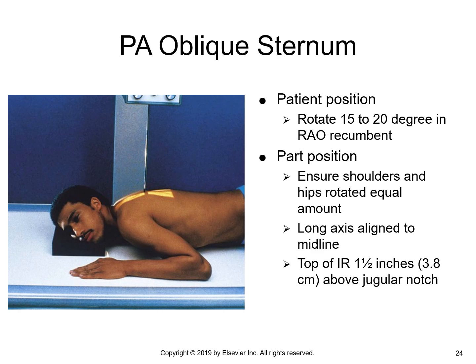Okay. Make sure your patient is running down the long axis of the table or is standing straight up and down and not leaning to the left or right, because that will affect how the sternum is oriented relative to your image receptor. Okay, there is no tube angle. It's a 40-inch SID. Actually, it's 30-inch SID, but most of your modern machines will have a safety override. It will not actually let you shoot at 30 inches. So the book can recommend it all day long, but the software controls typically don't allow it on our modern machines to shoot with a 30-inch SID. So 40 inches will be just fine. A 30-inch SID is going to have the effect of magnifying your sternum without losing edge detail.